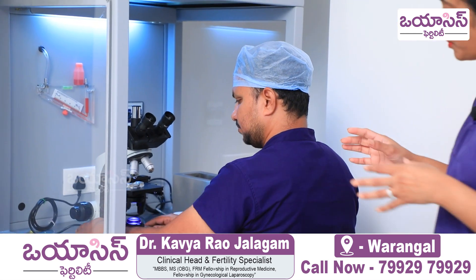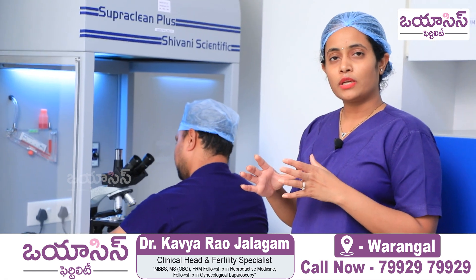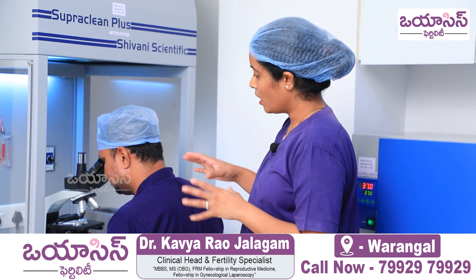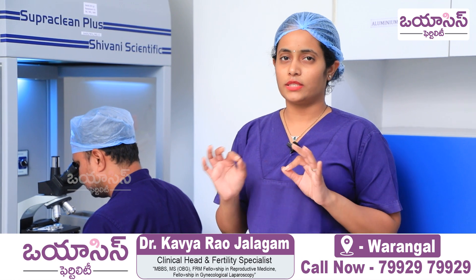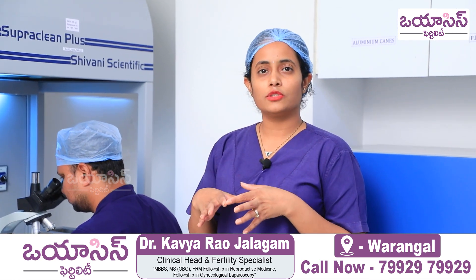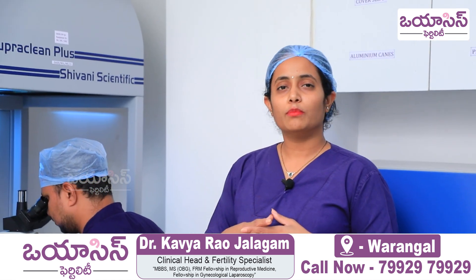We look at the sample under this microscope, examining sperm count, motility, and morphology. This is the first basic preliminary test to determine whether we should proceed with an IUI or stop at this stage.